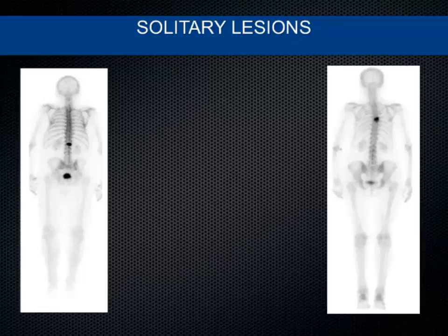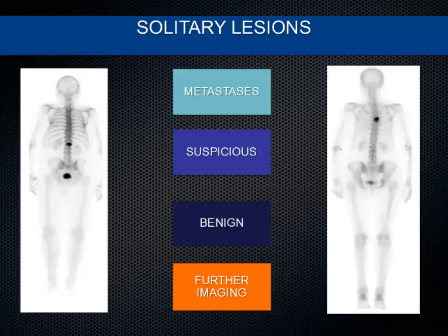And if you have a solitary lesion like this, then it becomes challenging for nuclear medicine people, because the clinical question there is, this patient has got cancer and they want to know whether it's a metastasis or not. Then, if we are the junior most, we can say, okay, possibly metastasis, because everybody thinks nuclear medicine means oncology. If you do a bone scan and it's hot uptake, then they think it's pathology. But often we get into this trouble.